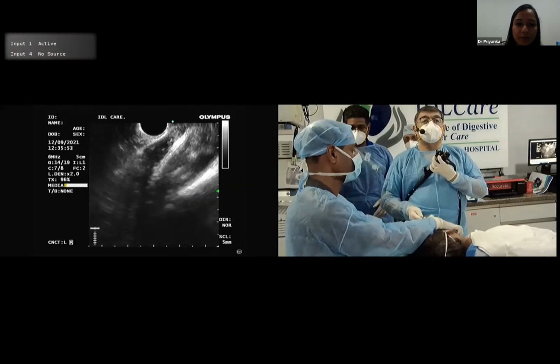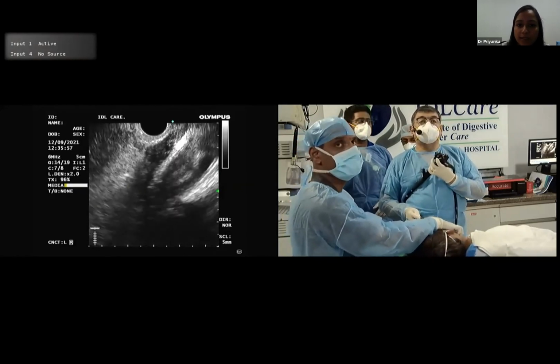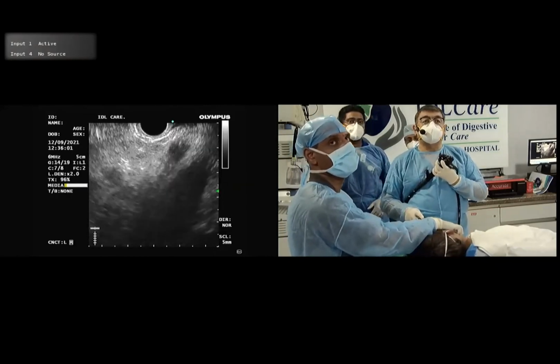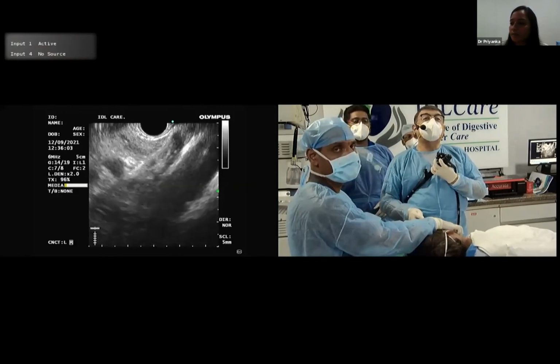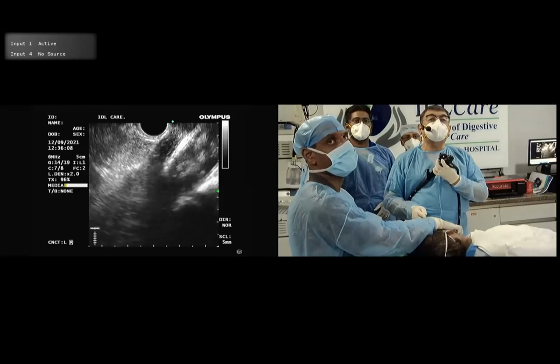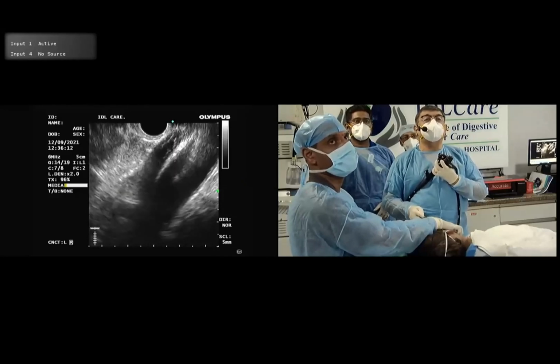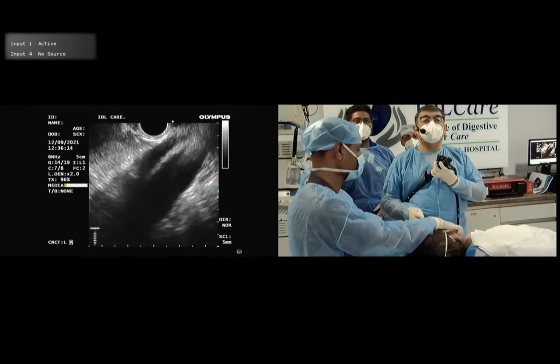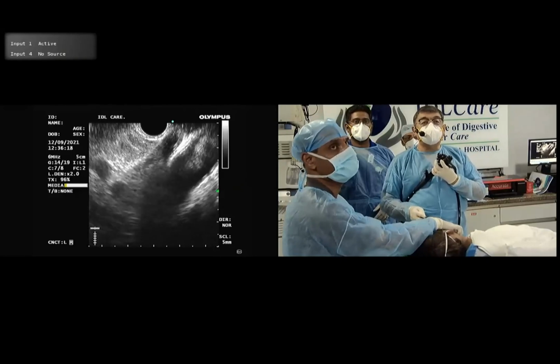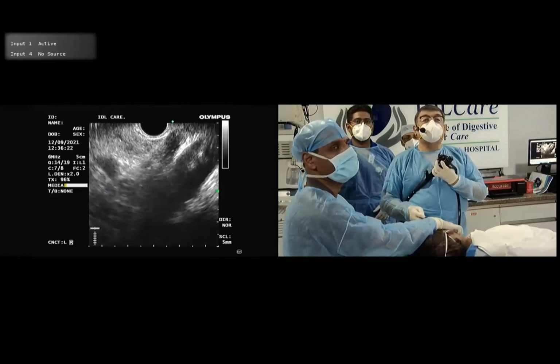And one question from Dr. Rawal. Is this slow pull technique the best? Yes, no doubt. See, there are a lot of things going on in EUS biopsy, and I like simplicity. For me, I do one technique and I stick with it. I don't go here and there, try 100 techniques. If you are focusing well on the lesion, if you are doing good fanning, you will get good tissue. There is no other way about it.